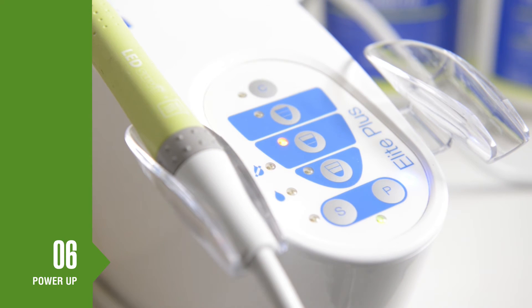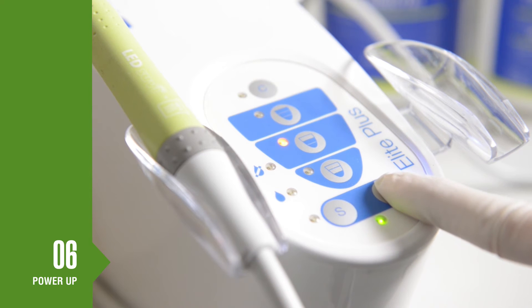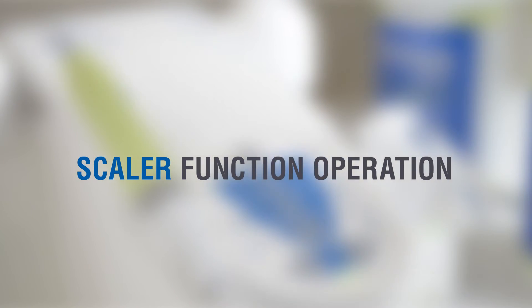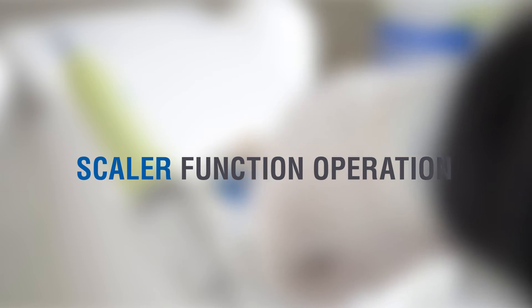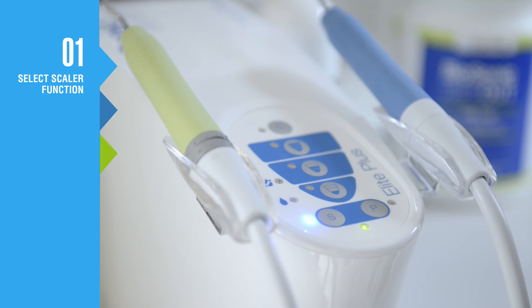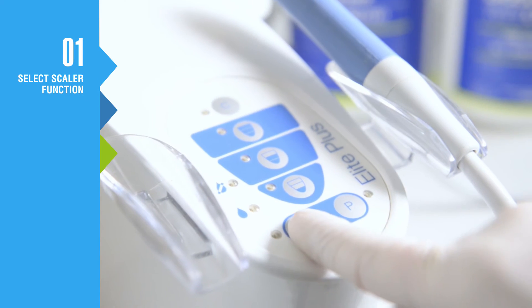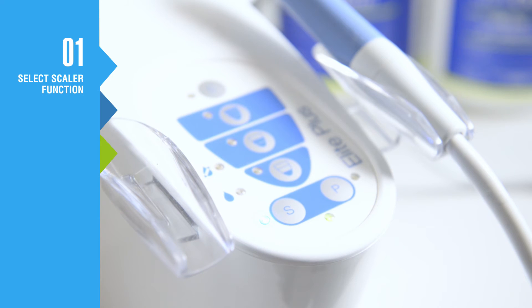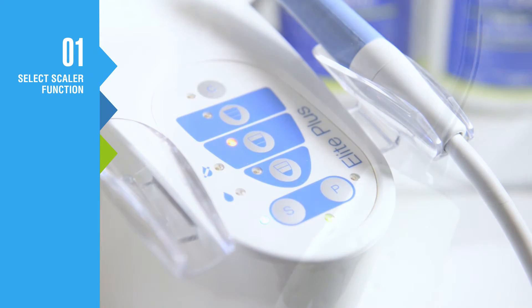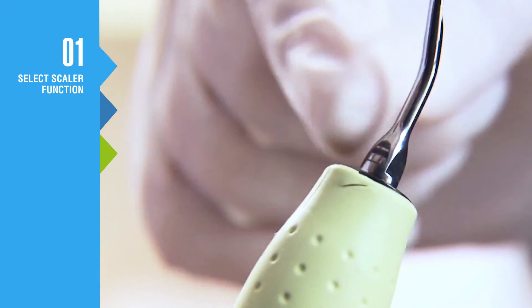To force standby mode, hold the S or P button for three seconds. With the unit in standby mode, press the S button to enter scaler mode. Select the working mode — one, two, or three — that matches the number on the base of your selected scaler tip.